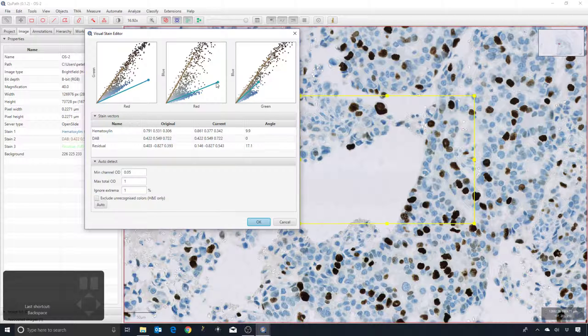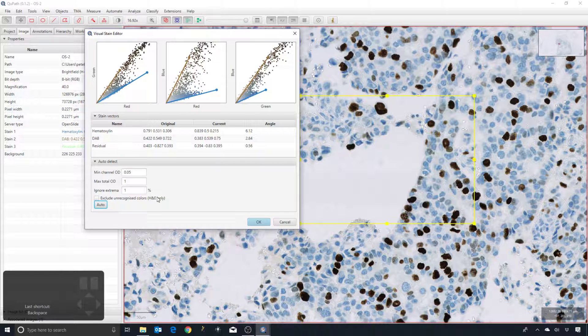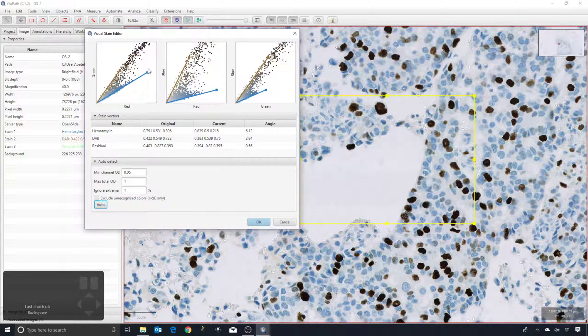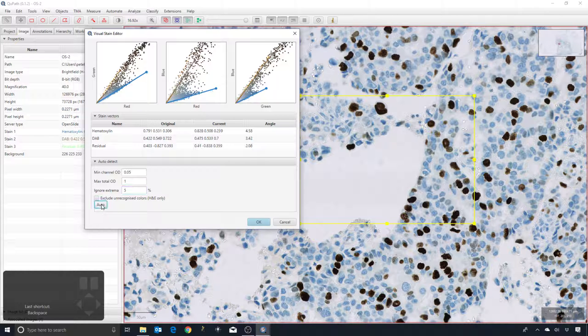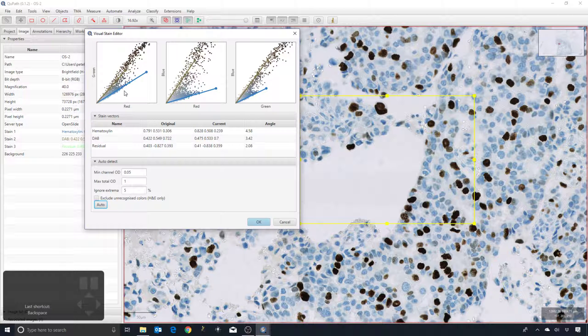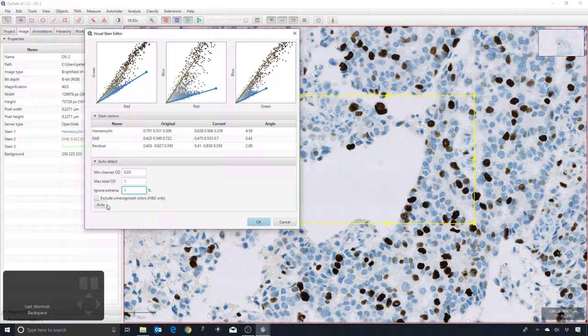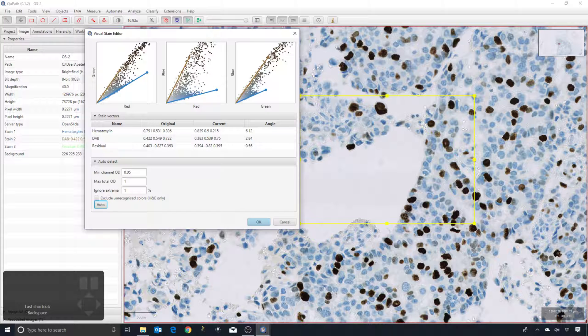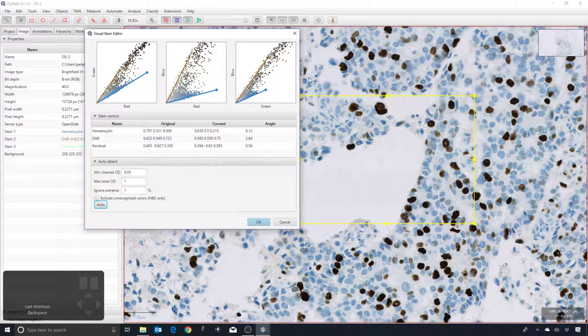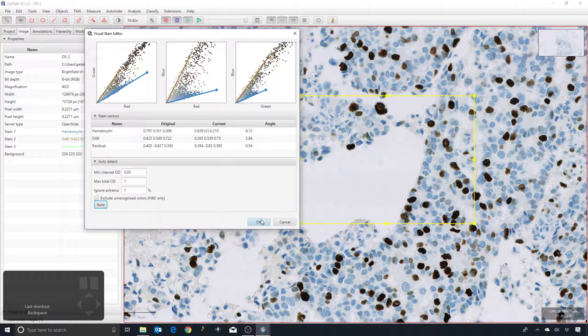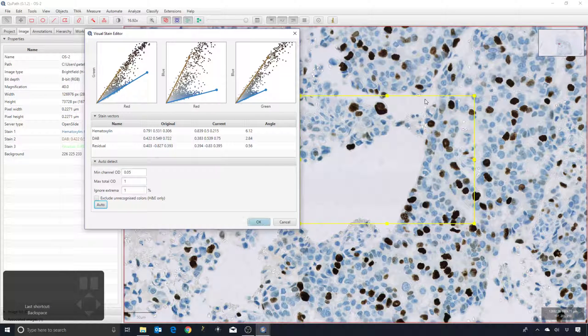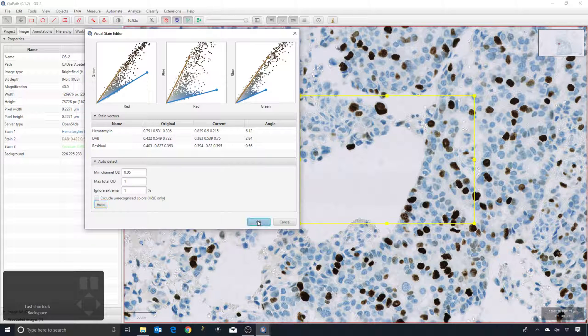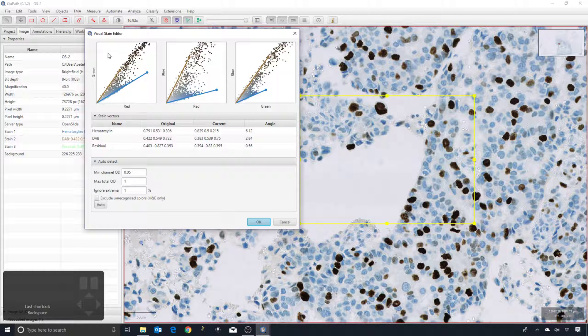What you can also do is you can press the Auto button and then QuPath will try and make a refinement. If you're not happy with it, then you can adjust some of these parameters or you can adjust the line itself. This one, for example, Ignore Extrema—you can see QuPath will give a bit of tolerance to allow some outlier pixels to be outside the region. If I increase this, it'll ignore more pixels, and if I decrease it, then it'll go further along the outside. You also want to try and make sure that your region doesn't contain like pen marks or other kind of colors that shouldn't be influencing the estimate. So it's not really a fully automated estimate; it's one that you can use and you can control, and the region of the image that you take is important.